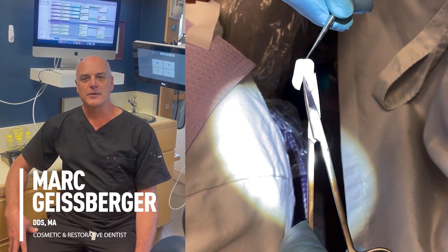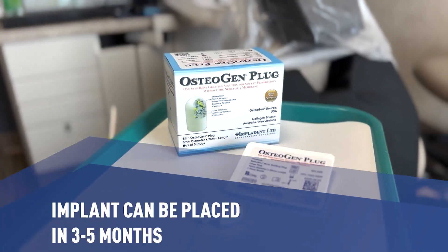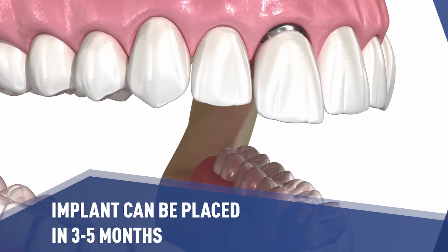Nine out of ten Catapult evaluators found it either easy or very easy to use in their practice. Impladent Osteogen Plug is a lifesaver and an incredible value for socket preservation when you need to grow bone for a future implant.